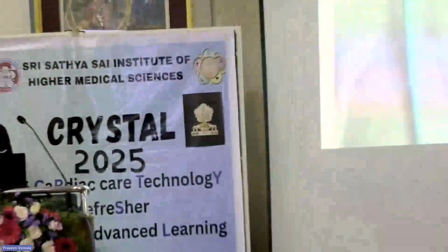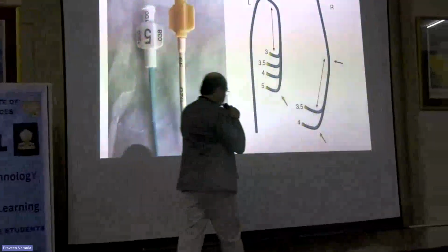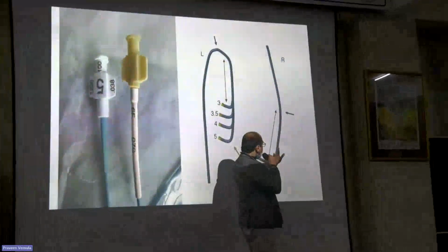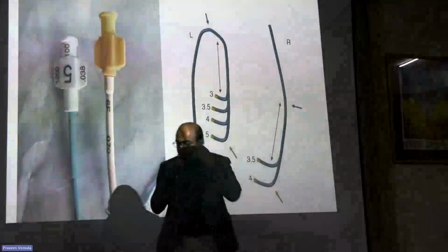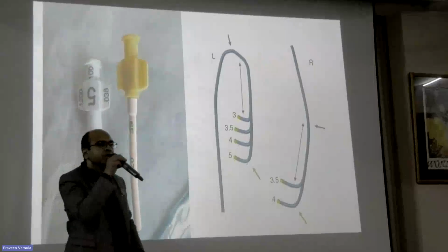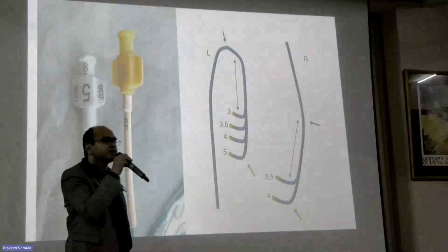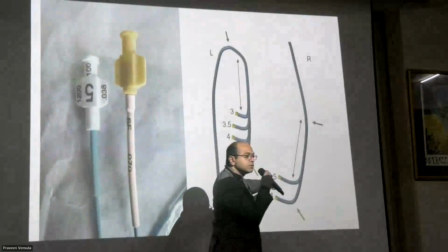The whole idea is that if you are using this, the essential point is that you are using the back wall of the aorta, right? And this is something that we ask in exam. Very few people know. You say it's JL 3.5. What does it mean? Anyone? When you say JL 3 or JL 3.5, what does that mean? It's written here, right? 3.5. What does that mean?